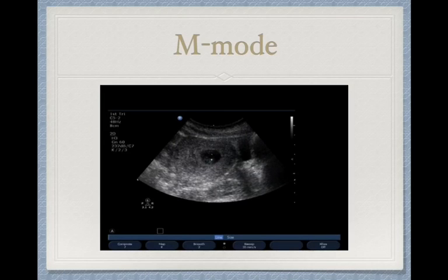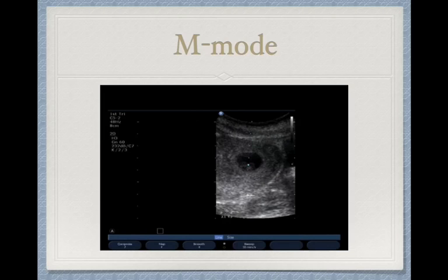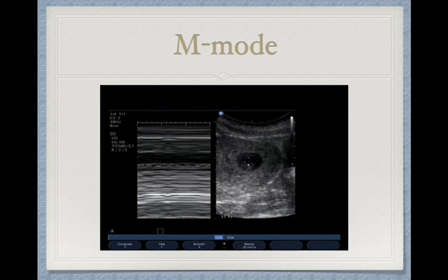So here's an example of somebody taking a fetal heart rate. You line up your M mode, run it over time. There's a little flicker there that's going to display the heart rate, and you can see right here there are some little flickers. To get your fetal heart rate, you may zoom in here a little bit. You may push the calc button, go to fetal heart rate. You would take your first marker there. We do a 2-beat peak-to-peak measurement, so we'd skip our next one and then go to our next flicker here, and that'll give us a heart rate.